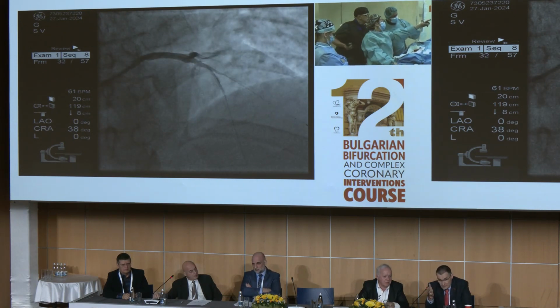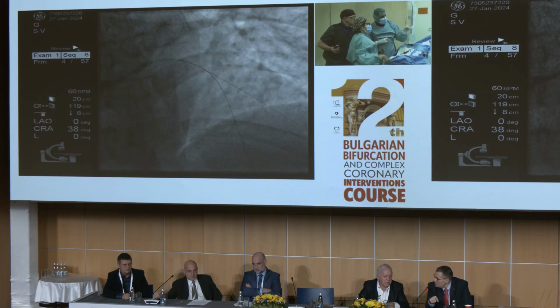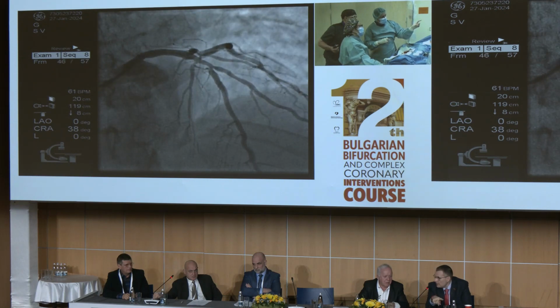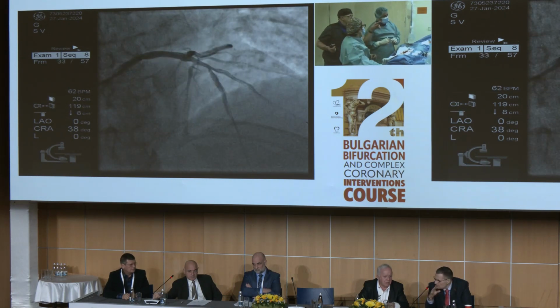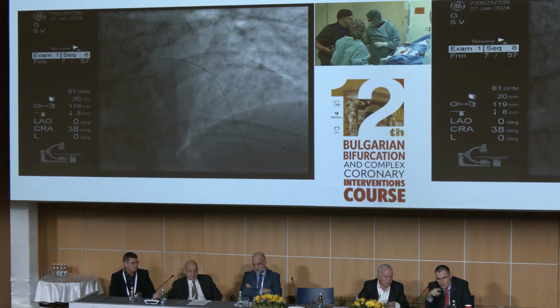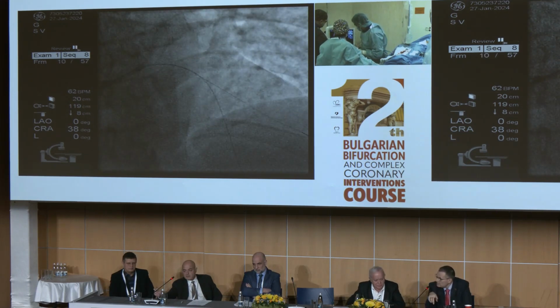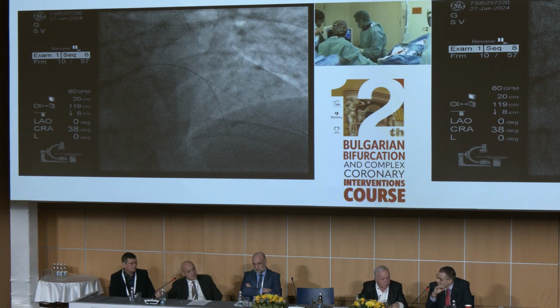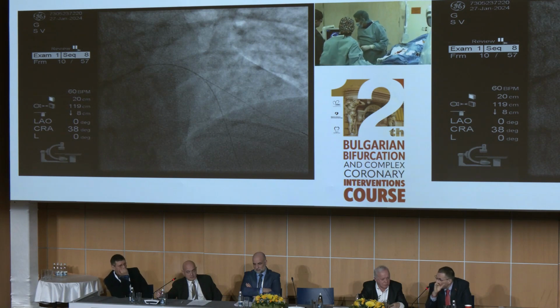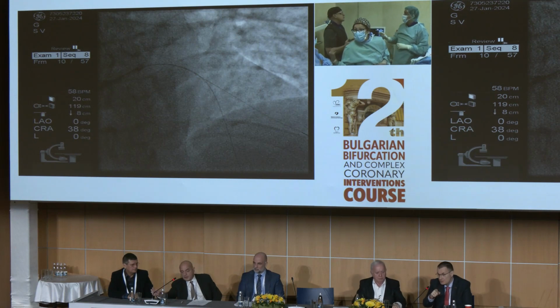If we want to cover the first diagonal also, I think they can switch to the better working frequency here, because the machine is mechanically arranged on 40 megahertz. It works on 40, but manually it could be switched to 60. If they have some doubts about the stent position, this IVUS is very good regarding this assessment, and there are several regimes of work, especially for the lumen delineation or even for the plaque. It depends on what you want to assess with this machine.